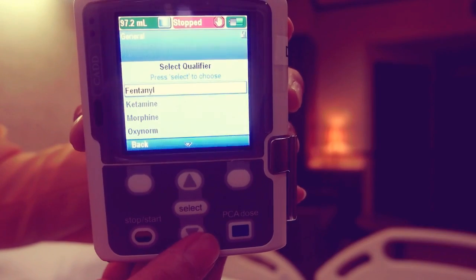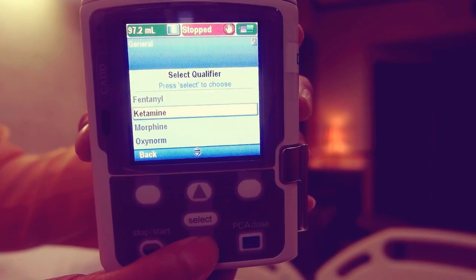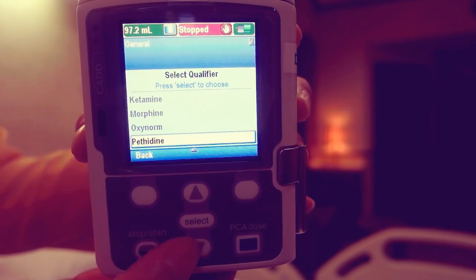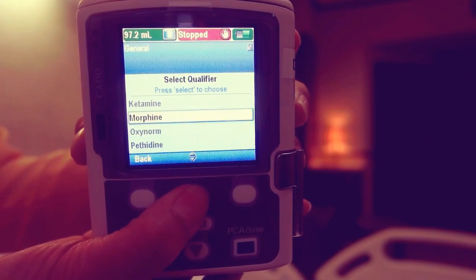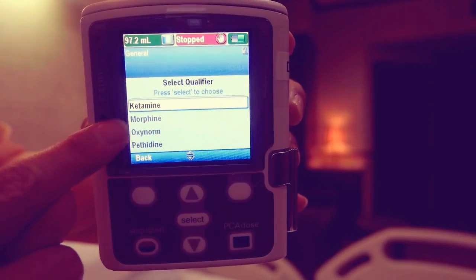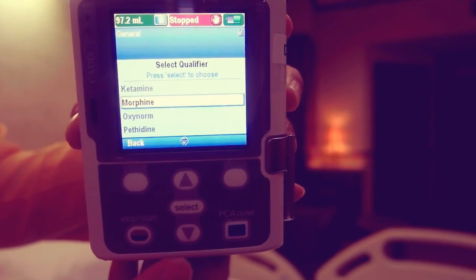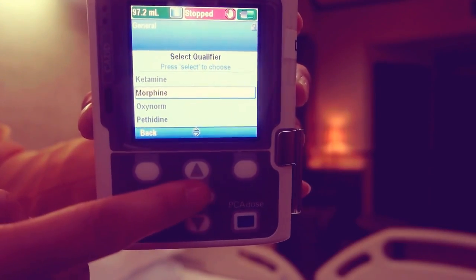Scroll up and down again to highlight the desired qualifier. If your desired qualifier is morphine, highlight morphine and press select.